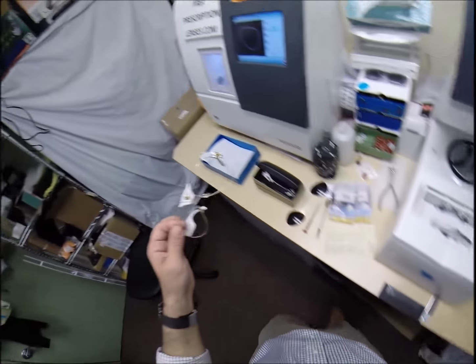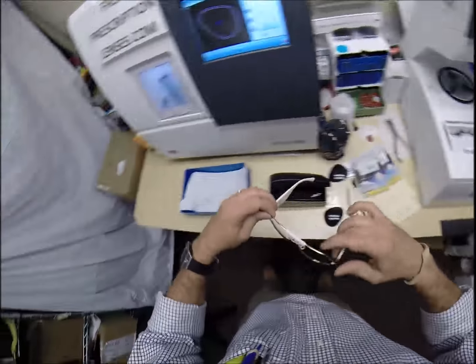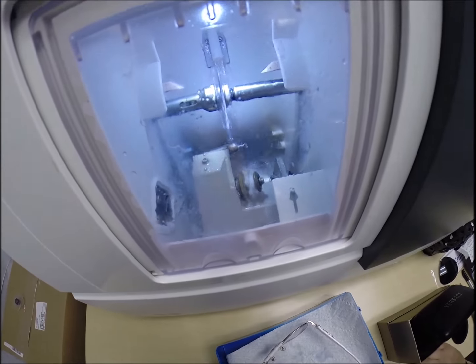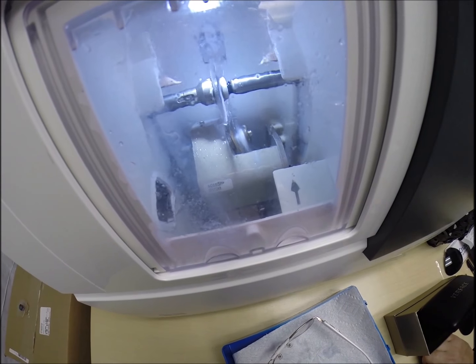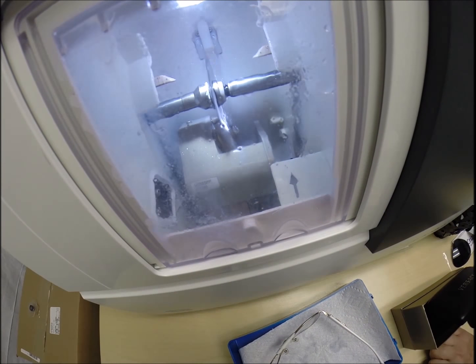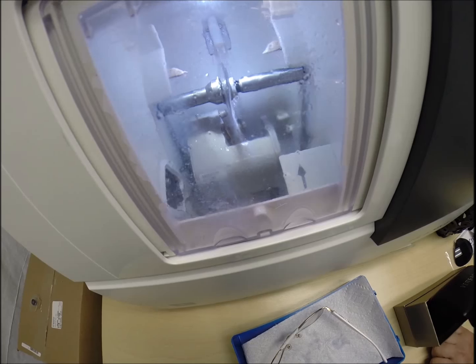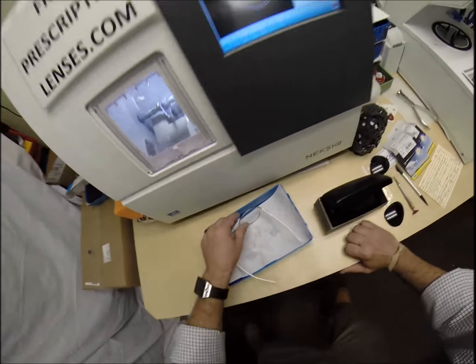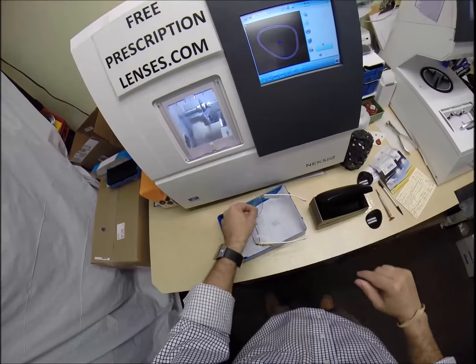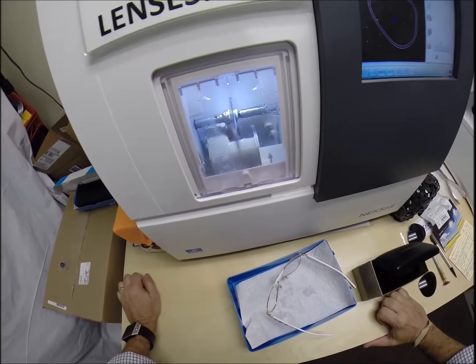Come back down here. Go ahead and put the frame there, since we know we'll be doing that soon. So out comes the lever. At the end of that lever is a spinning wheel, something you would find on the end of a Dremel tool, and that's what's applying the safety bevel to the back surface of the frame. Should any portion of this lens protrude from the back of the frame and come into contact with your cheek, it'll be nice and smooth.